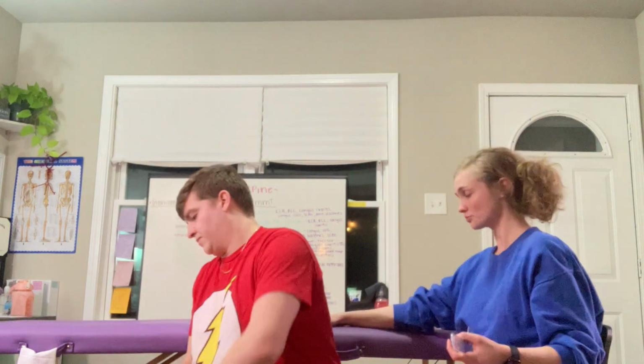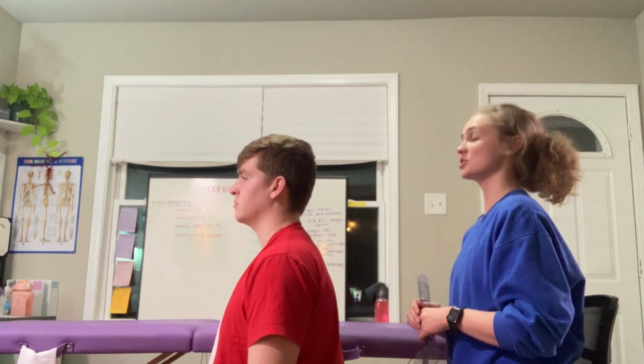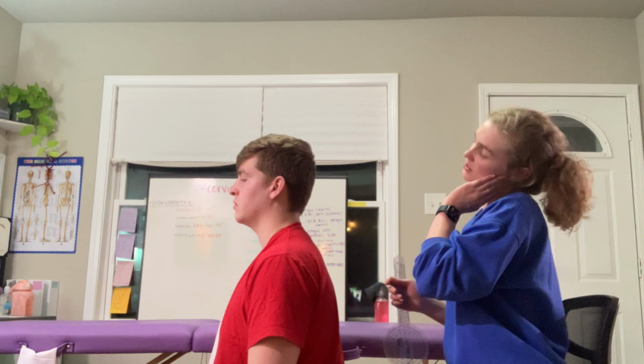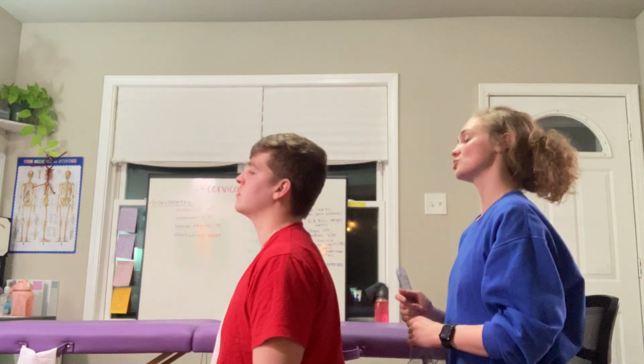For the next measurements, I'm going to be sitting behind my patient. Thank you, patient. And now what we're going to be doing is measuring how far our patient is able to touch his left ear to his left shoulder, and then his right ear to his right shoulder.